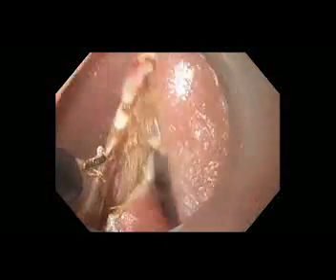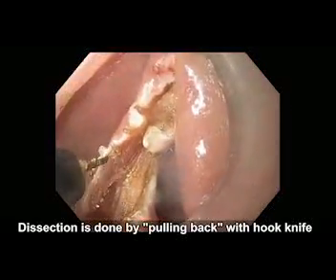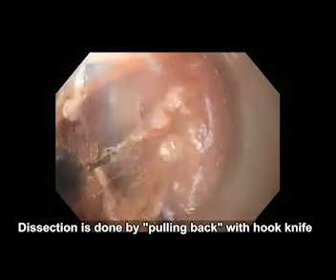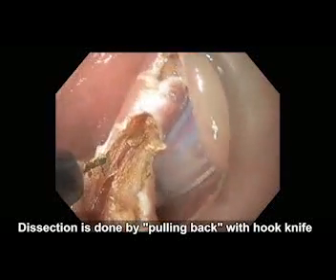This also allows the dissection to be completed by using a pulling back technique with the hook knife in order to complete the cut. This avoids putting forward pressure on the posterior esophageal wall and minimizes the risk of perforation.